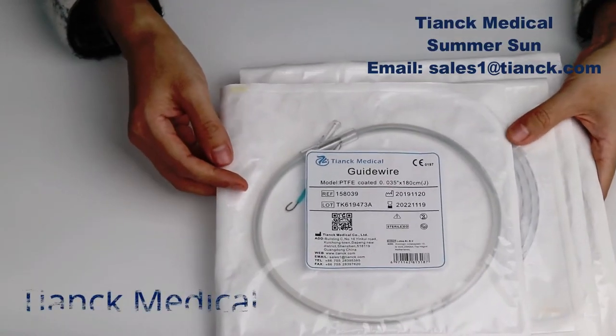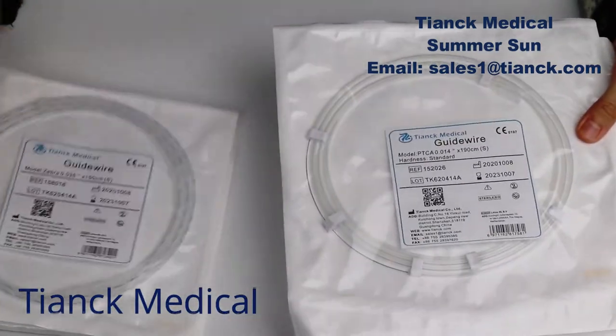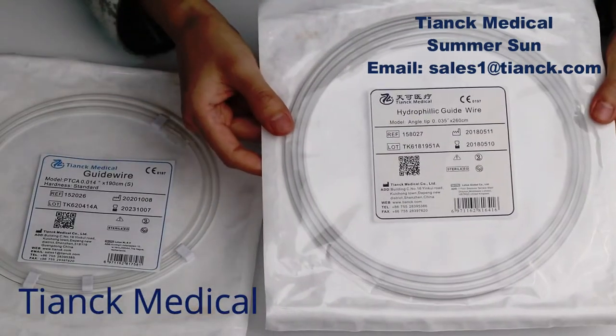We have a wide option for guide wires. Here we have PTFE guide wire, Zebra guide wire, PTCA guide wire, and hydrophilic guide wire.